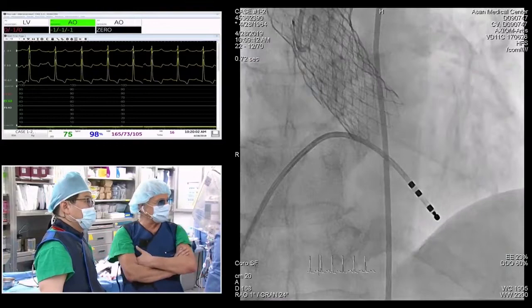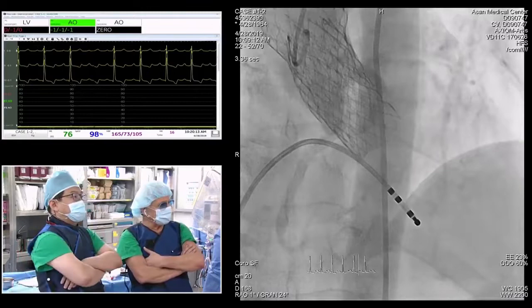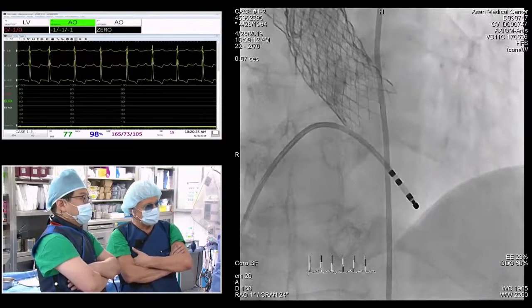This is good. The patient is stable. Noteworthy, the coronary perfusion is still there. The patient didn't have any EKG changes. And you can see where the valve is, where the leaflets are. To be honest, as I promised, I would like to access the coronaries, because obviously that was and is a challenge.